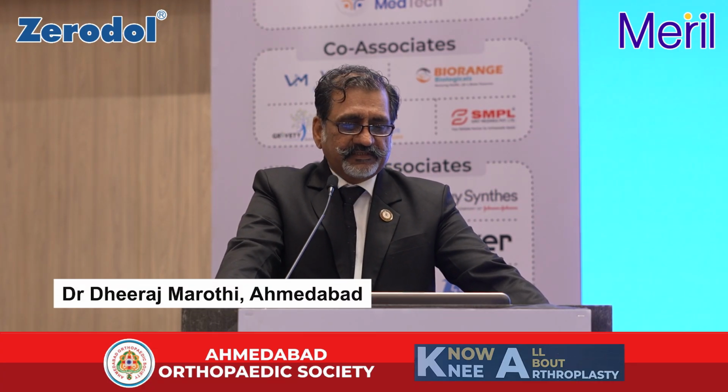Valgus and recurvatum. It's a complex situation to handle. Unusual, less than 1% of patients. We all know the pathoanatomy: stretching of the posterior capsule and PCL, bony collapse on the distal femur and proximal tibia. The problem to be dealt with is a large extension gap versus a small flexion gap.